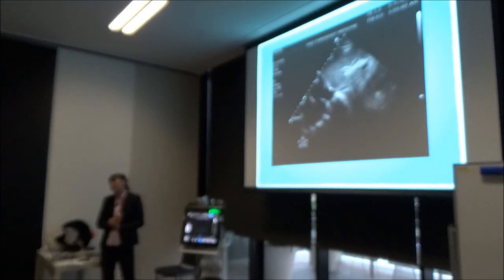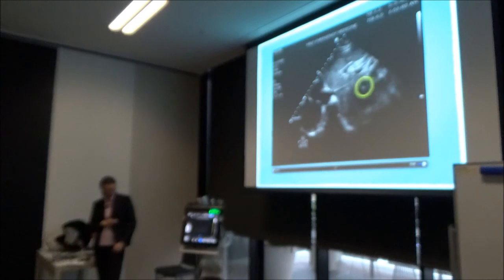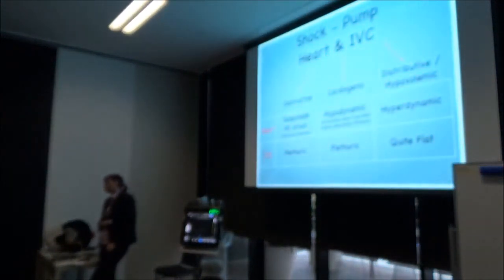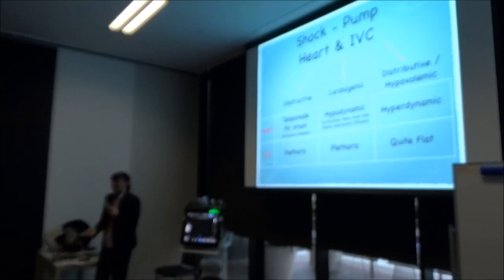And I gotta say, when you're really, really dehydrated, it's really hard to see your IVC sometimes. So here's a very thin strip of fluid that indicates your IVC. Hard to tell. That's a summary of the pump. And I hope with those series of cases, you can start seeing how we do resuscitation and shock assessment at the same time.